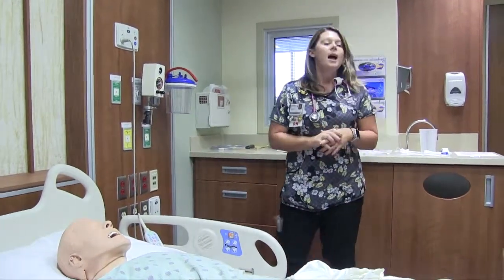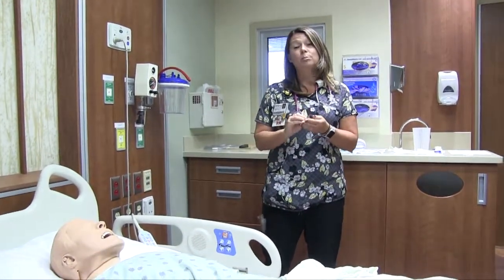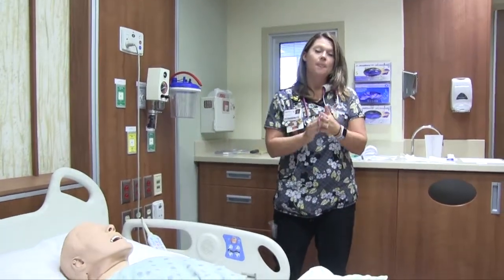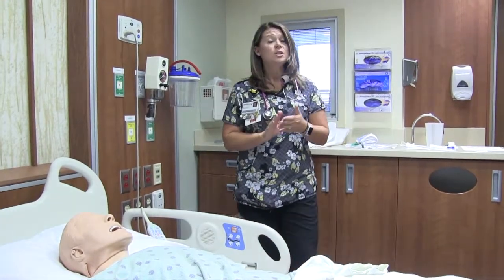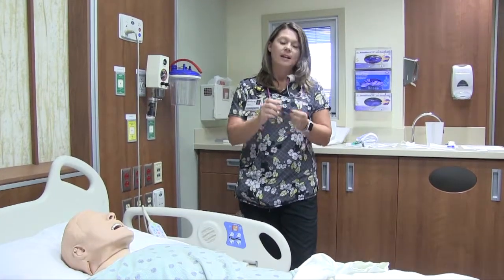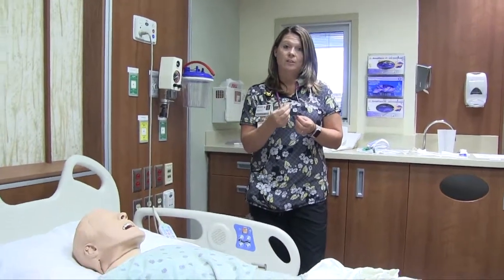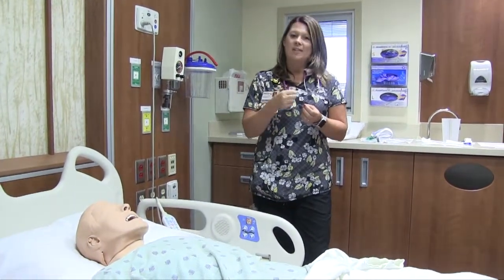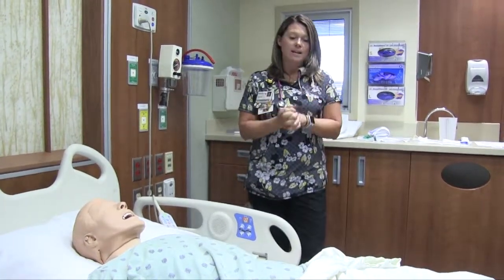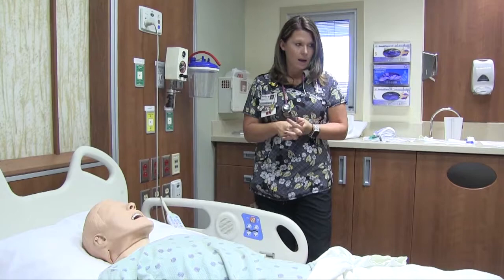Another thing that is kind of expected is some patients do have a mucousy or bloody discharge right at the end of where the catheter inserts into their body. This discharge is normal. So don't be concerned if it happens. Just make sure that you are cleaning that area, getting all of that discharge off. And sometimes that's where it's helpful to use your fingers when you're cleaning, because you can feel that discharge a little better with your fingers than you will with a washcloth. Always make sure that your hands are clean when you're messing with your catheter. That's really important as well.